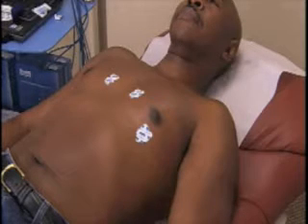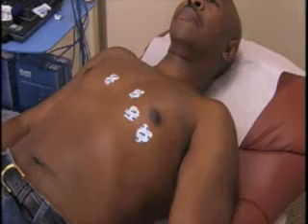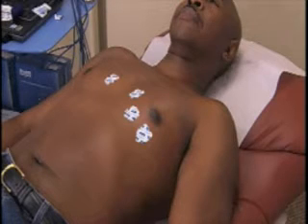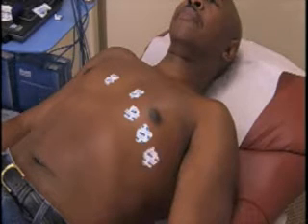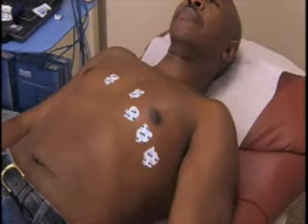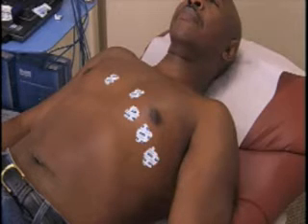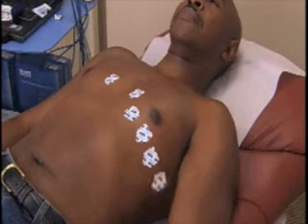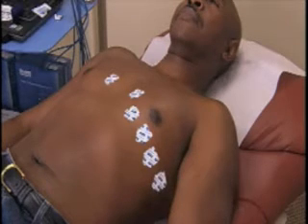Macrodiagnostic statements can be viewed and edited by clicking on the edit diagnosis button. To delete an interpretation, highlight the line and click on the delete button on your computer. Adding to or changing the interpretation can also be performed in the edit diagnosis dialog box.